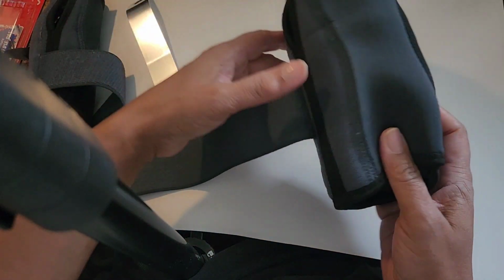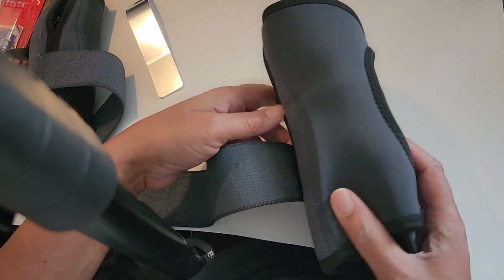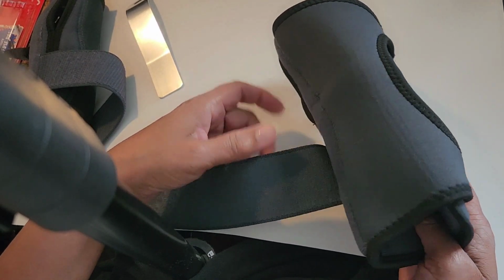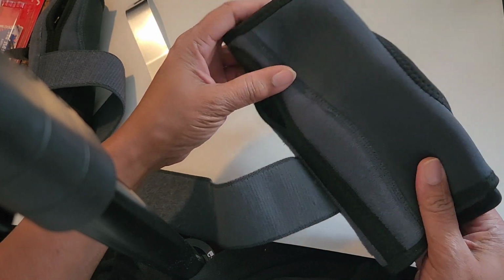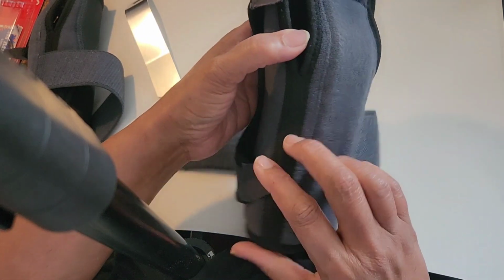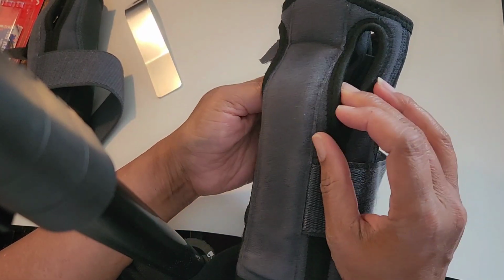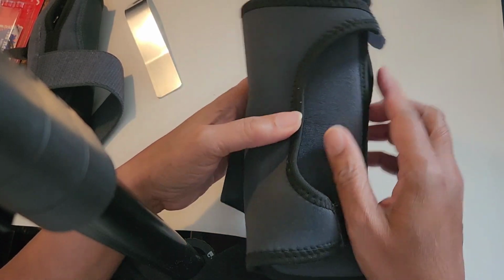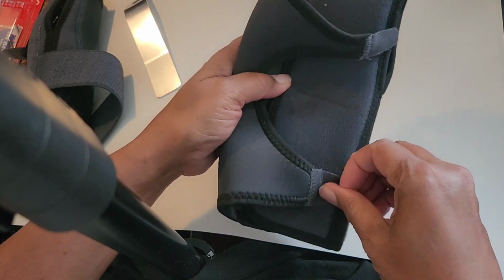So this is the one that I have. It's actually from CVS, but you know, there's some online that work the same. He told me to get a left and a right one, and I got a left and right one. As you can see, the two holes here show left and right. I got a large, and this is how it looks on the inside.